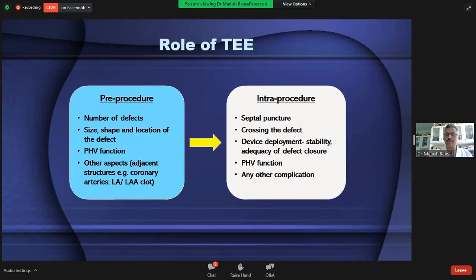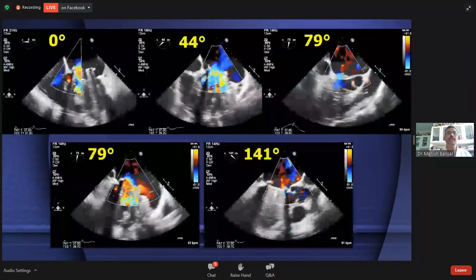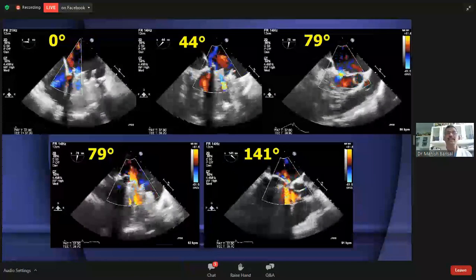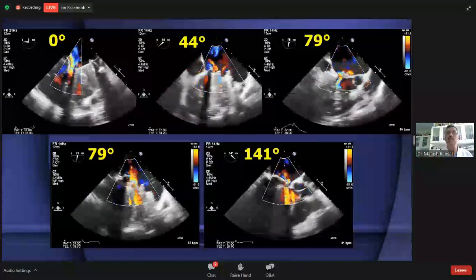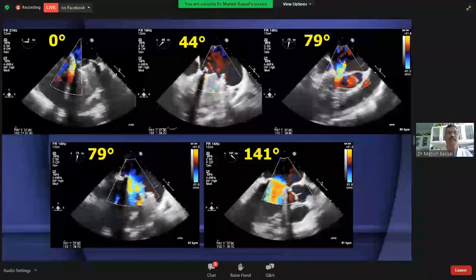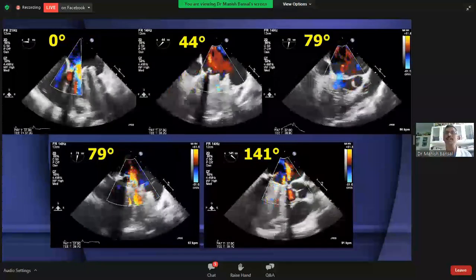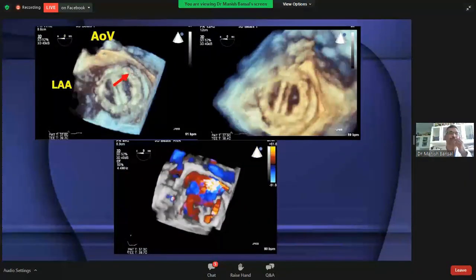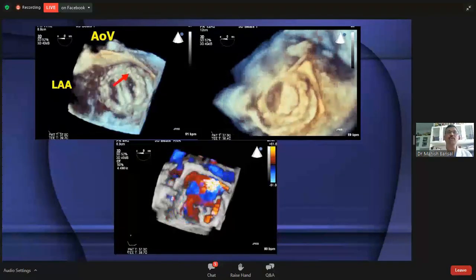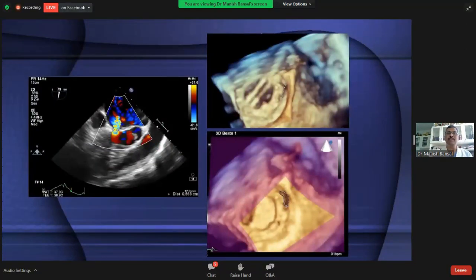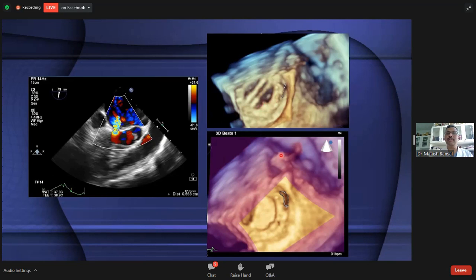During the procedure, the whole process is performed under echo guidance. In this example — a patient with paravalvular leak around the mitral valve — the jet origin is seen in the zero-degree view and in the 79-degree view, but from these 2D images it is very difficult to determine how many defects are present and where exactly they are situated. Switching on 3D immediately shows a defect in the region of around one to two o'clock, and it is clearly a large defect. Not only can we locate the defect, but we can also quantify it, assess its shape, and measure its dimensions — including the total length and shape required for procedure planning.